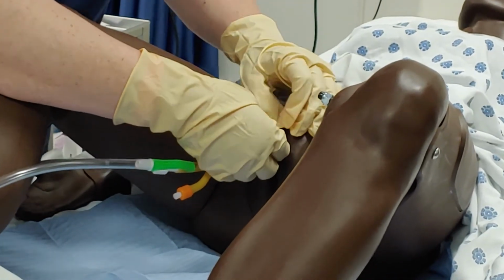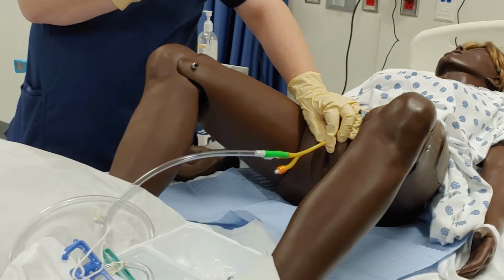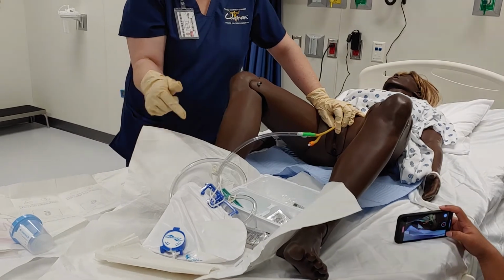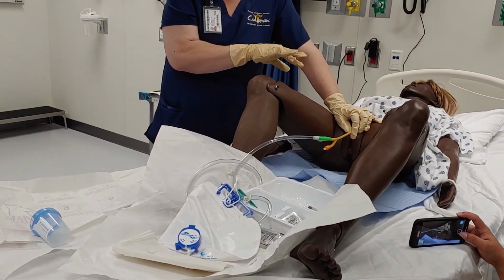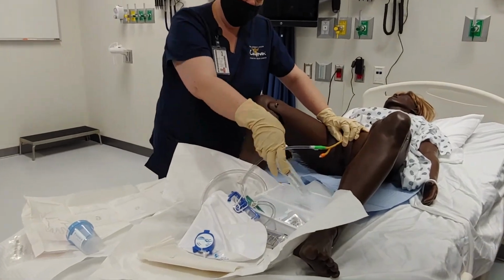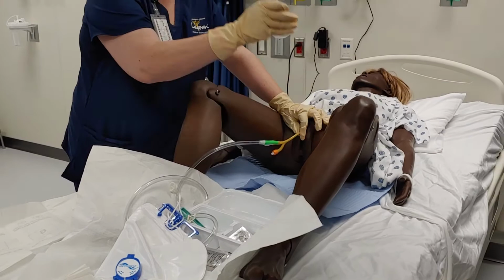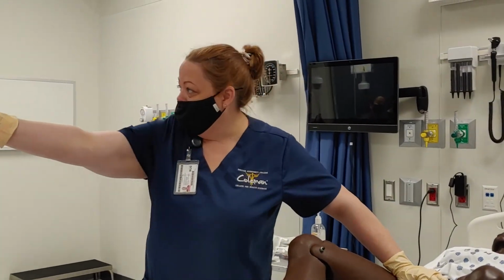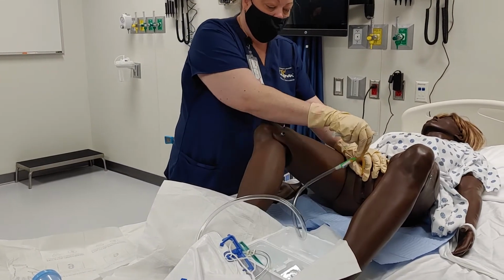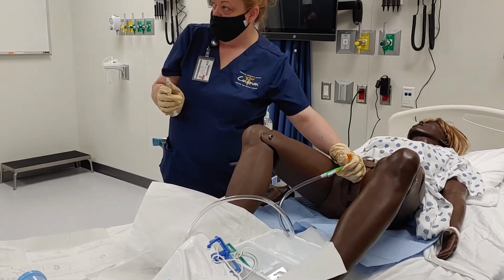Okay, so once that is in, I'm then going to use my non-sterile hand. Now, automatically you would see urine coming in this, okay? But, again, I don't think it was filled enough. While I'm holding this, I am now going to take my syringe, okay? My syringe that has 10 cc's of normal saline in it. And I am going to attach it to this end, this orange end.